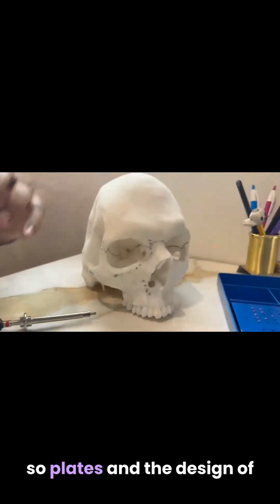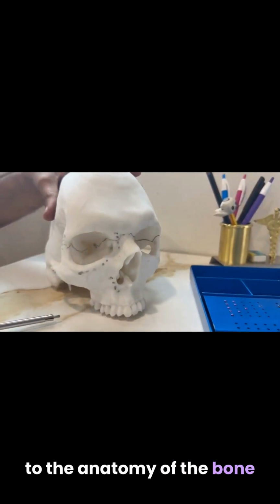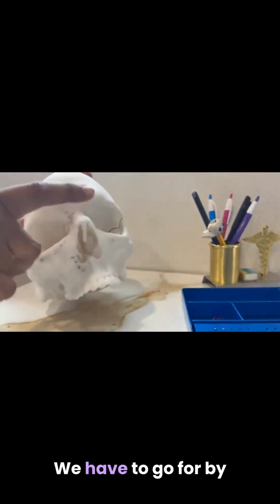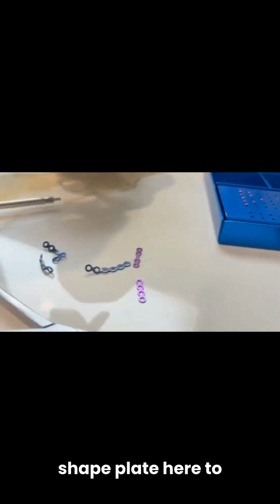Plates and the design of plates must be according to the anatomy of the bone which is involved. If the nasal bone is involved, we have to go for continuous mini plates of 1.5 mm, or we can use a T-shaped plate here to stabilize this bone.